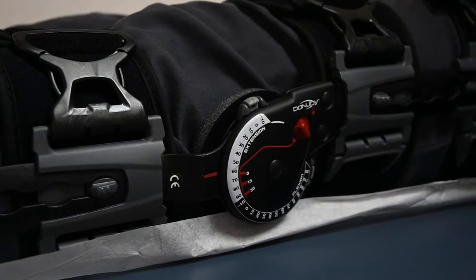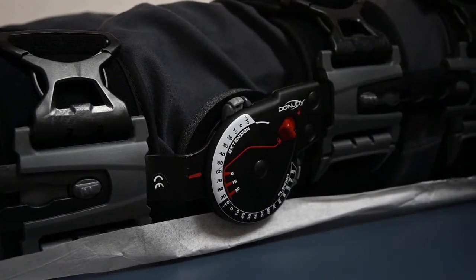You can unlock the brace at times, such as if you are sitting in a car for convenience. However, whenever you are ambulating or whenever you are placing weight on your knee, the brace must be locked out straight.